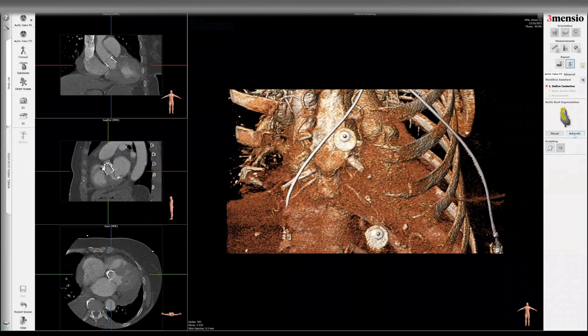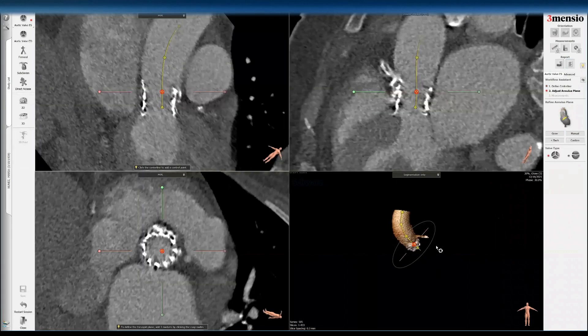First we're going to click on automatic segmentation. The first step is to evaluate which CT phase gives you the highest resolution of the transcatheter valve. The reason being there can be blooming artifacts or motion artifacts that make it more difficult to assess coronary obstruction risk, as well as sizing and positioning of the second transcatheter valve.